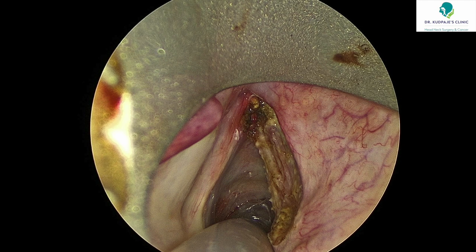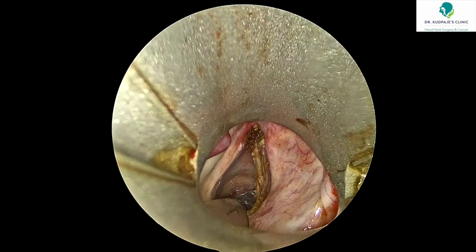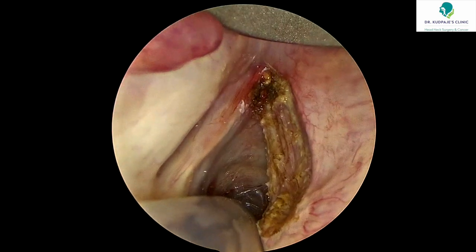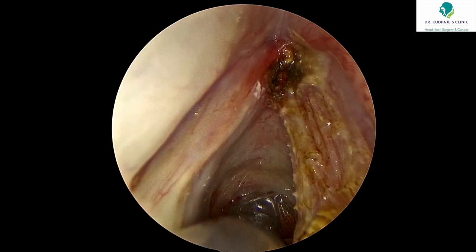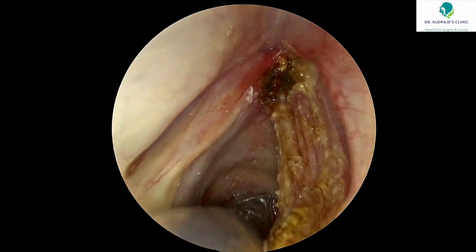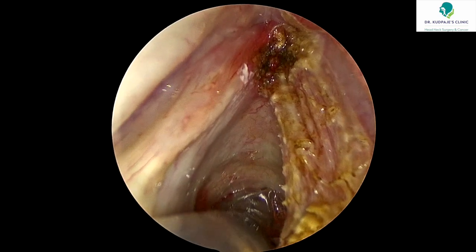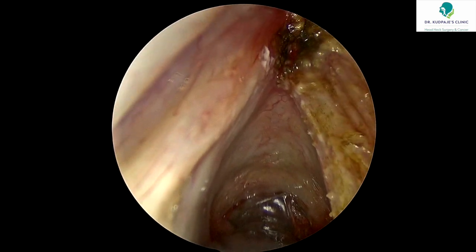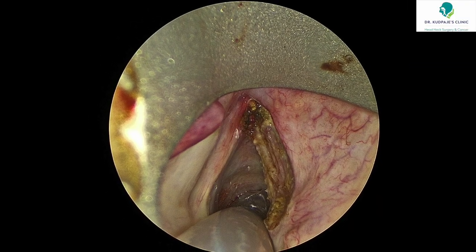That is the post resection, a type 2 cordectomy defect. Entire length of the vocal cord, you can see a very clean cut and a very smooth thyroarytenoid muscle, which is very important. When it heals, you have an even surface and a good mucosal wave or mucosal healing happens there, and with good compensation of the normal vocal cord on the opposite side, we get good voice outcomes. The charring of the anterior commissure is because of the cauterization in that area.